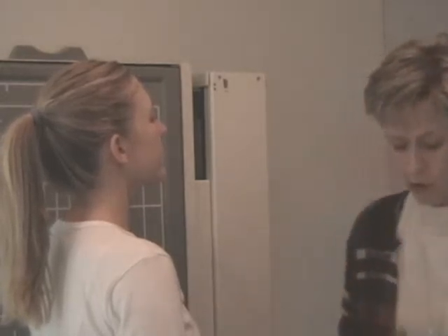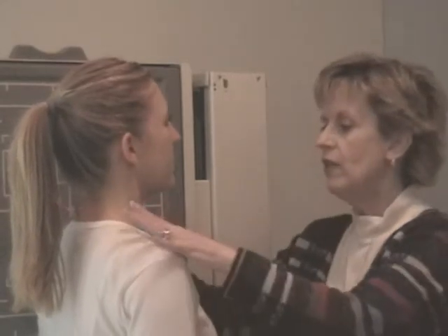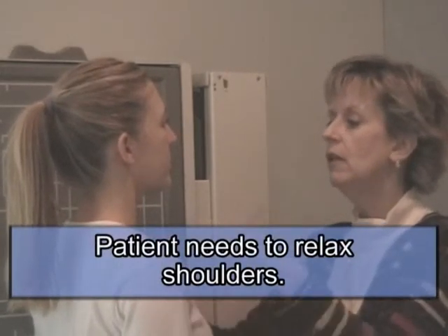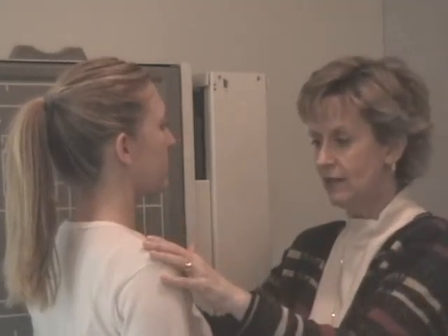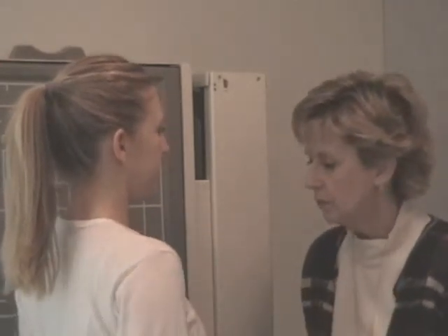If she has big shoulders, just before you make the exposures, do not have them hold the sandbags any longer than necessary. Just before you make your exposure, give them the sandbags and tell them that they need to relax their shoulders. You can actually have them take in a breath, blow it out. Do that yourself and feel what your shoulders do. They actually relax down. And then C7 might be better demonstrated. Okay, we can have the sandbags now.